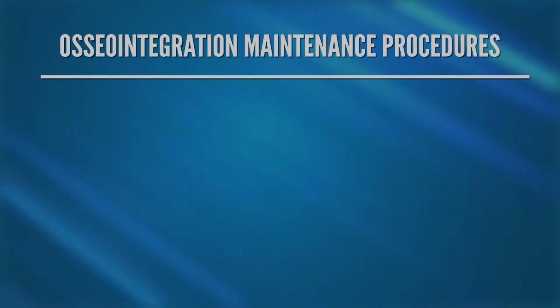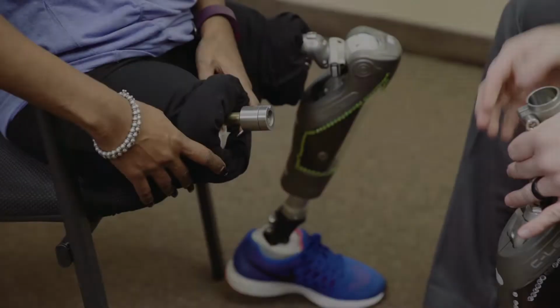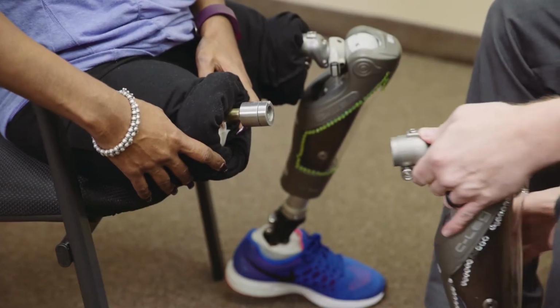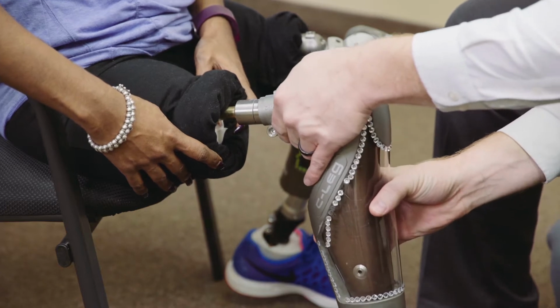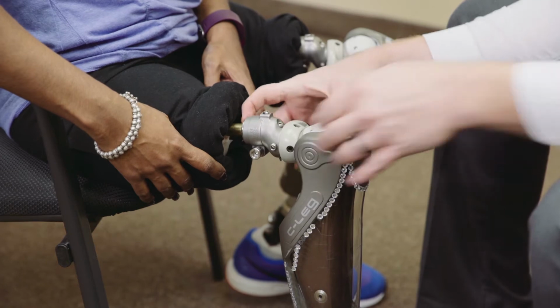maintenance. The first process we will discuss is attaching prosthetic components. There are two types of systems that are currently being delivered to the patients. Both systems require the patient to have a 4 mm and 8 mm Allen wrench on hand at all times to don and doff the prosthesis.